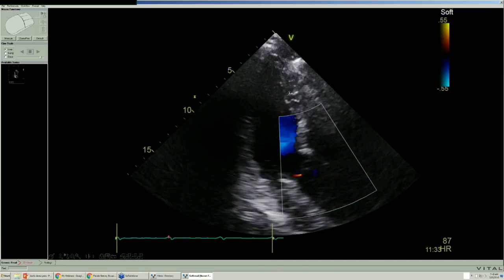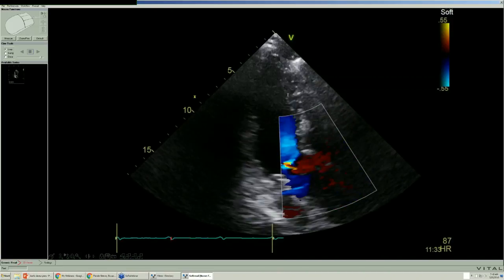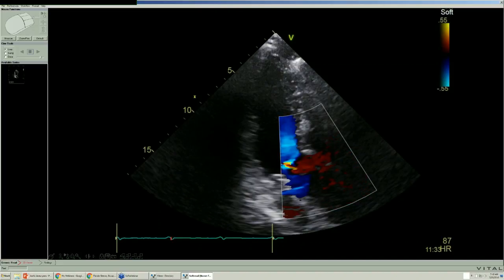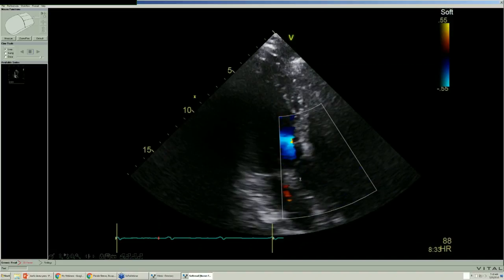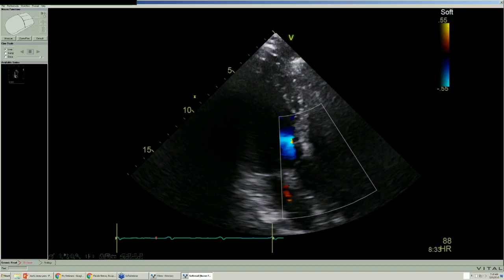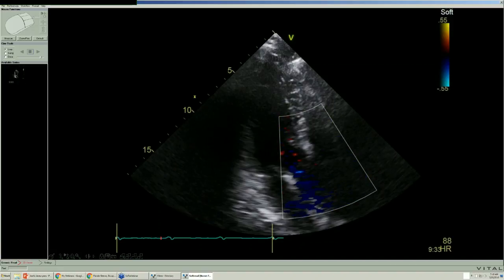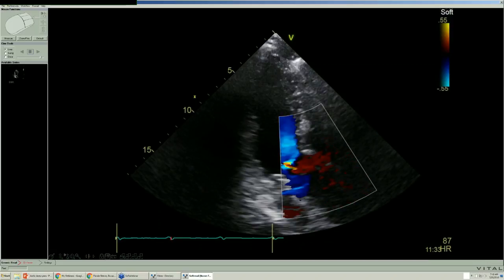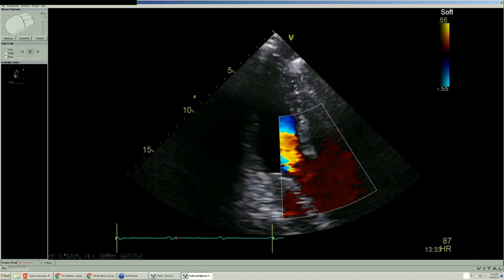We want to know if there's aortic regurgitation, or leakage of the aortic valve, and there's very slight leakage, we'll show you right there. It doesn't really count, but that's what you worry about. If you dilate the annulus, what's going to happen to the leaflets? They're going to get pulled apart, and they're not going to coapt well. That hasn't happened in this particular patient, and there's no bicuspid aortic valve, which would predispose to that. So that's a good thing.